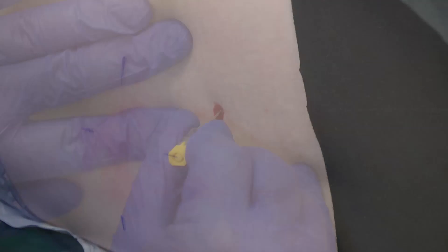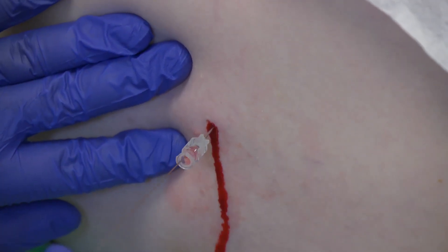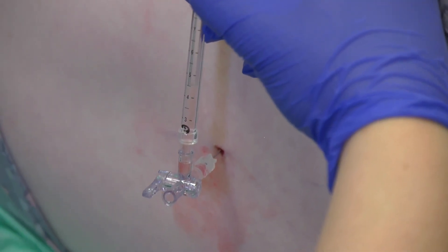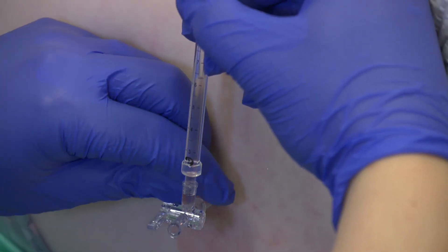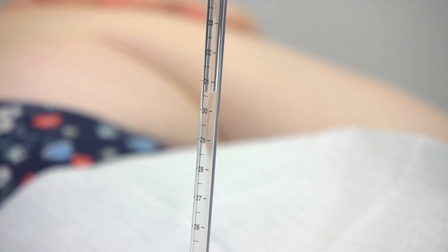Proceed to cleaning the skin, inject local anaesthetic into the skin, and insert the spinal needle. In this patient, who is known to have raised intracranial pressure secondary to idiopathic intracranial hypertension and was attending for a therapeutic drain, a larger gauge needle was selected. Measure the opening pressure and collect the samples as usual.